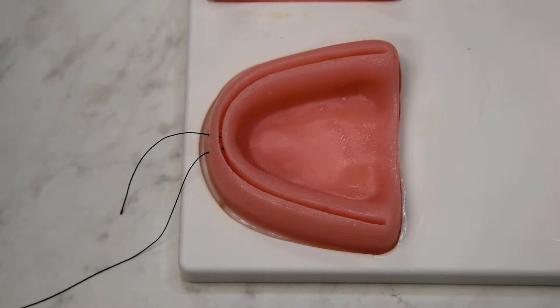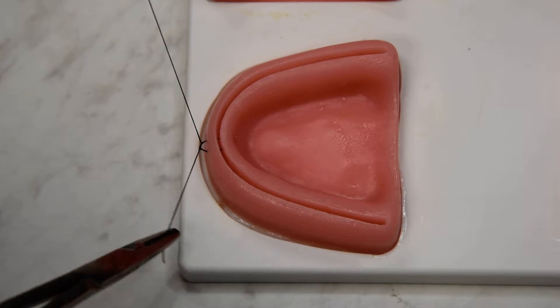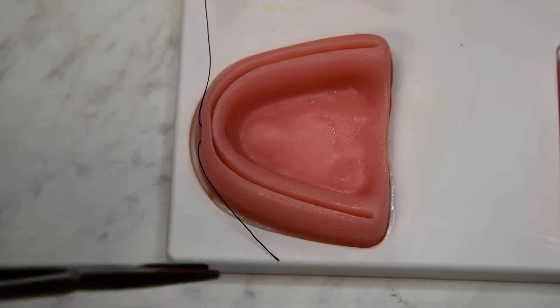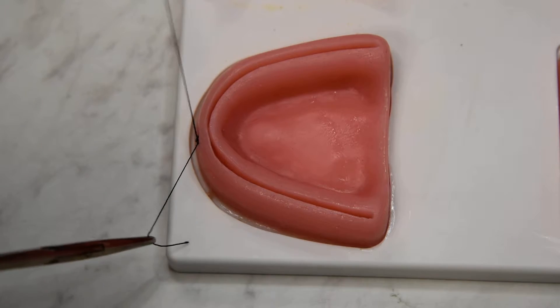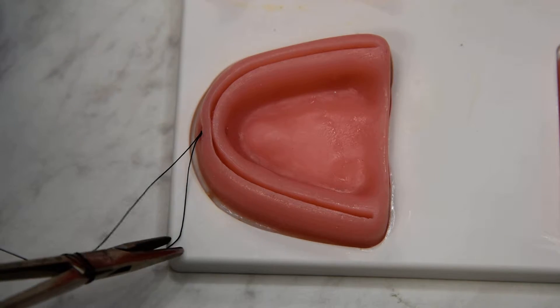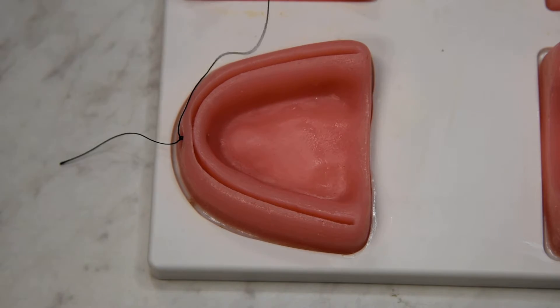So a little horizontal mattress suture here at the midline, we'll go ahead and tie. And I'm going to leave my tail right where it is.